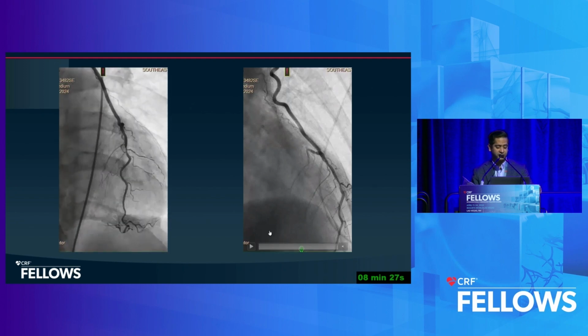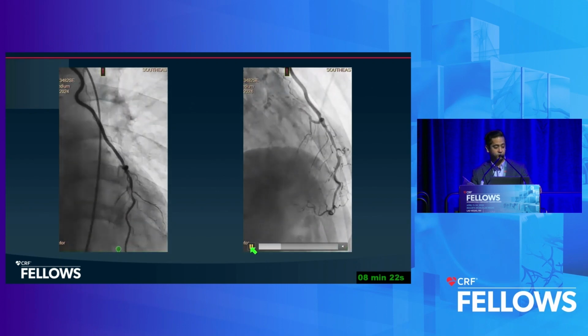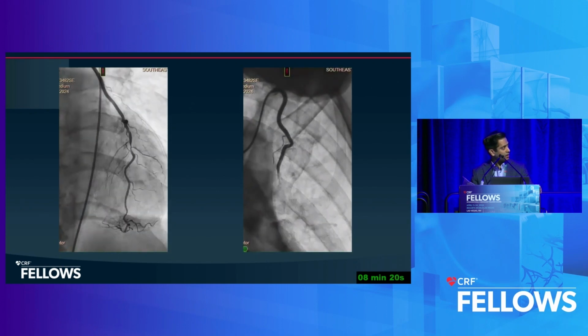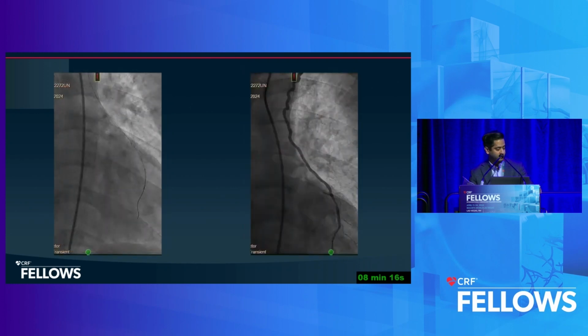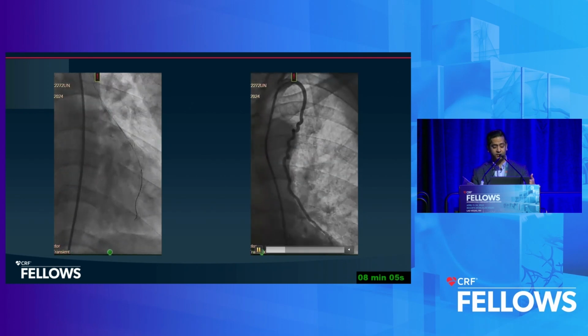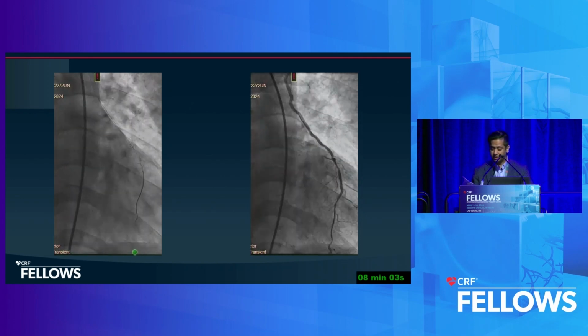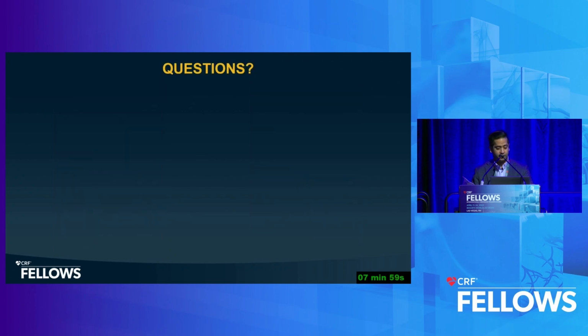And as you can see, there's a very tortuous bend. It's a lot of these LIMA grafts, and it can make it very difficult to wire. And these are from the diagnostic images from the outside cardiologist. So he's a 6 French IMA guide. We were able to get our Mamba guide wire down actually very easily. We did have to pre-dilate. We tried to direct stent it. We couldn't deliver the stent down there. We had to pre-dilate, put a stent in, and we got a great result at the end of it.